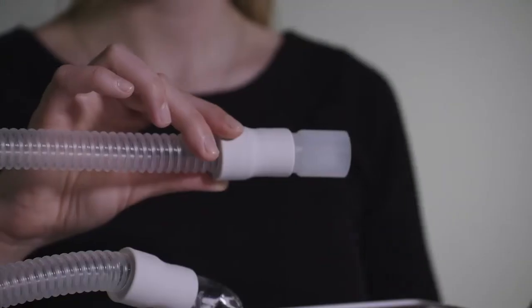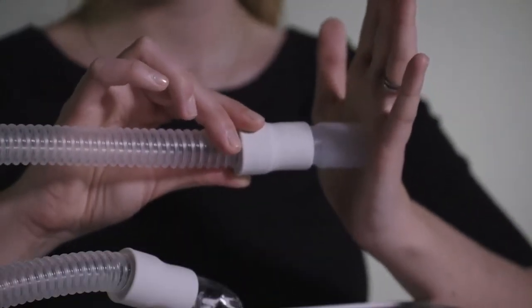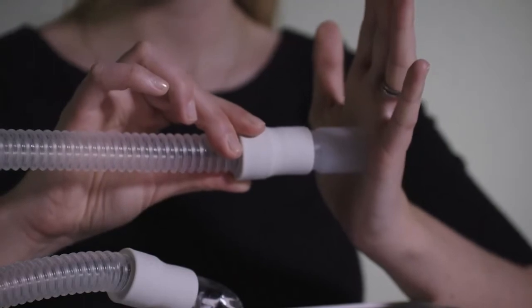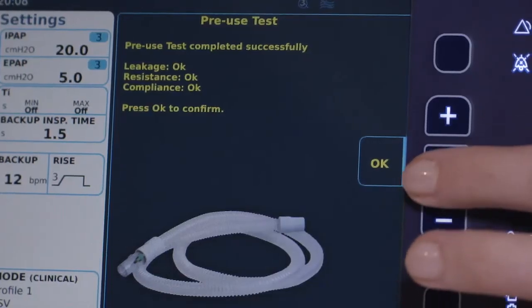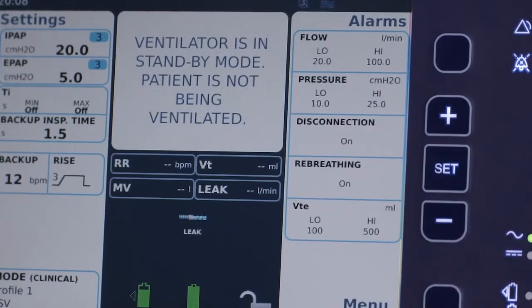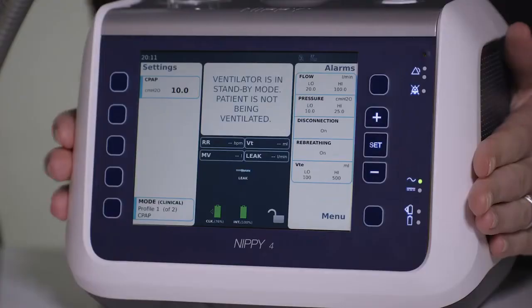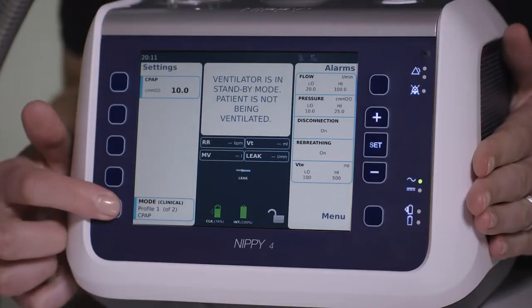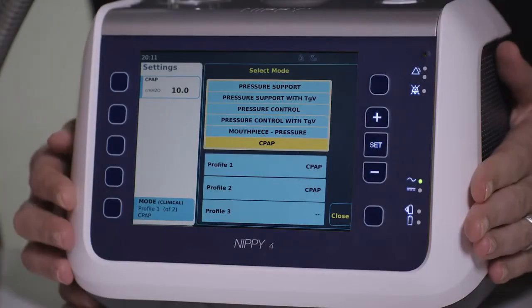This setup will be saved until you do another pre-use test or clear the patient settings. Next, select a treatment mode. To do this, press the bottom left button to access the mode menu.